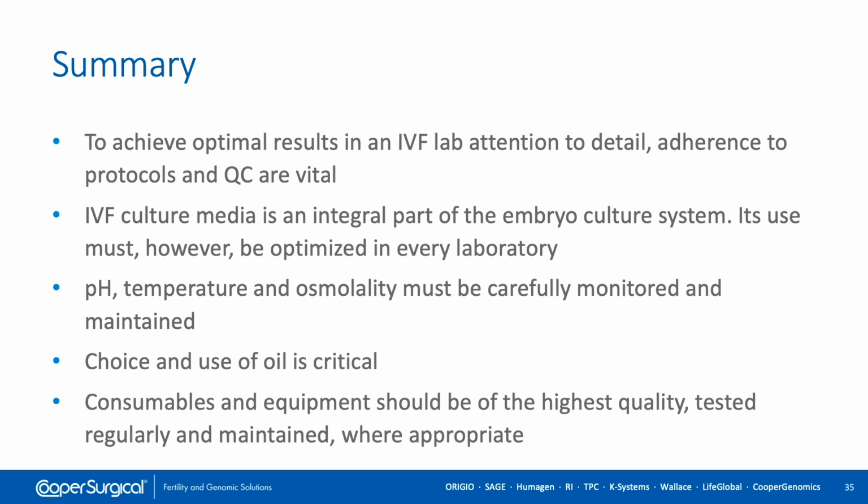We need to adhere to the protocols as much as possible and follow SOPs, and quality control, quality assurance is vital. IVF culture media is an integral part of the embryo culture system, but it's not the only part, and therefore we must optimize other factors, and every laboratory has to work out the optimal conditions for itself.